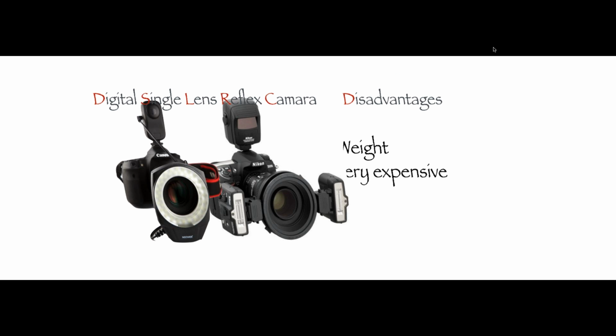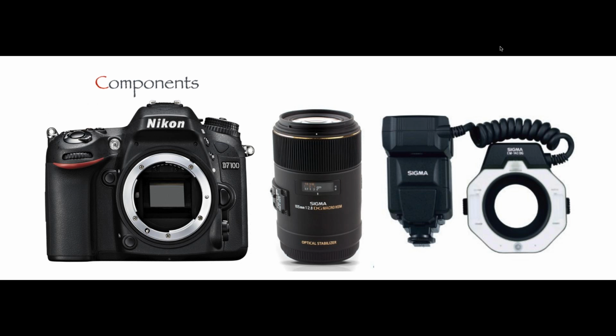And I do everything. I hold the camera with one hand. I have my patient retract. I hold the mirror with the other hand, and I'll show you step by step the position that you have to have in order for you to achieve high quality photos.